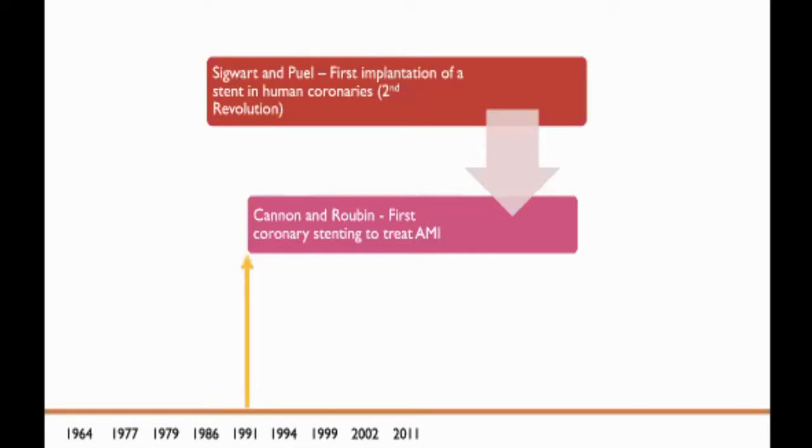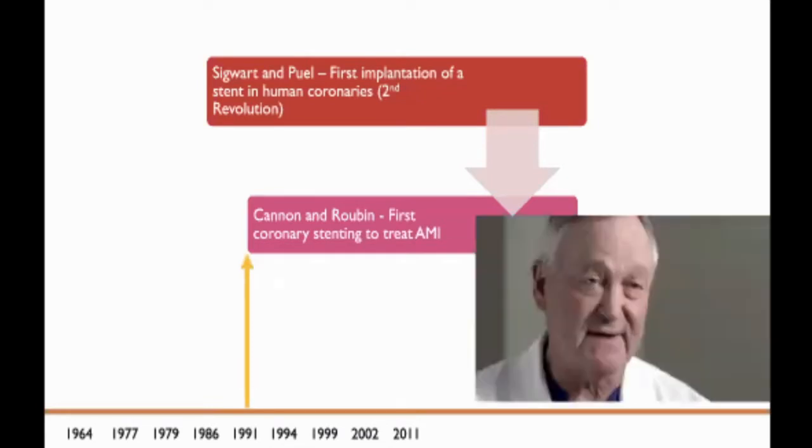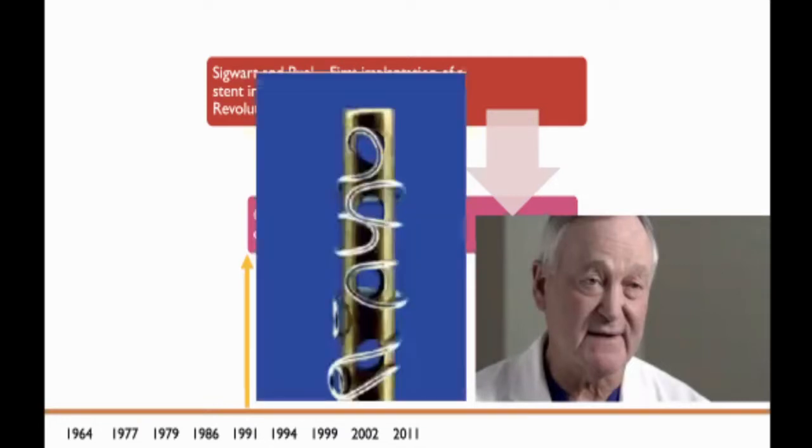The next year was 1991. Gary Roubin, who developed a stent contemporaneously with Cesare Gianturco, gave us what is also known as the Gianturco-Roubin stent. It was a balloon expandable coil stent consisting of a wrapped stainless steel wire resembling a clamshell. A phase 2 study evaluating the Gianturco-Roubin stent to reverse post-angioplasty acute coronary artery vessel closure was started in 1988, ultimately leading to United States FDA approval for the indication in 1993.